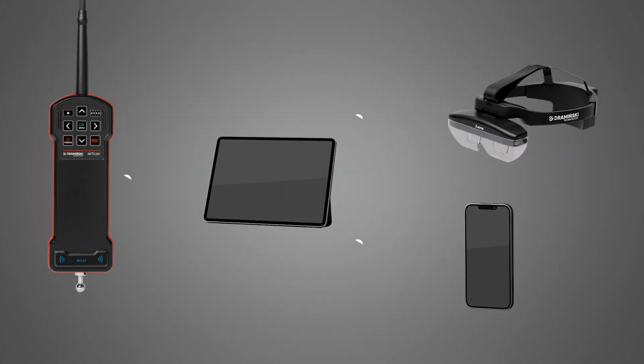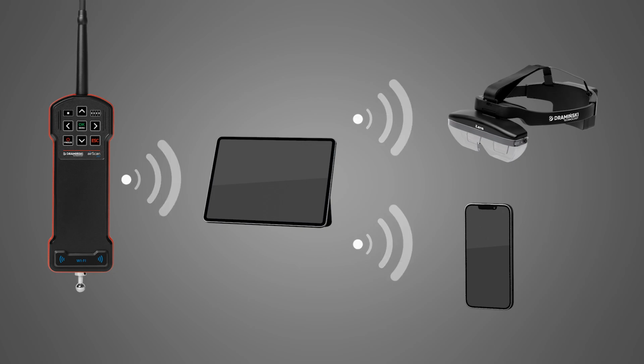If you want to connect your iLens goggles, contact us to receive the correct update that will enable streaming. The iLens goggles will connect automatically when turned on. If you are having trouble connecting your goggles, turning off the displays by shortly pressing the power button to put it into standby mode and then pressing it again will refresh the list of nearby devices searched for.